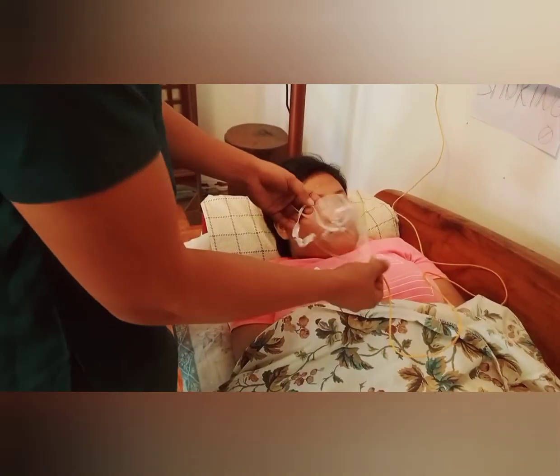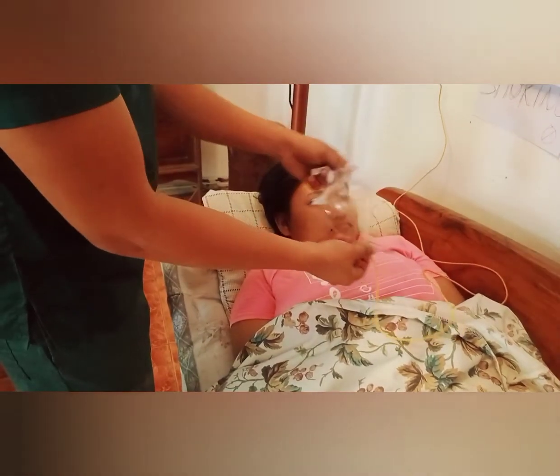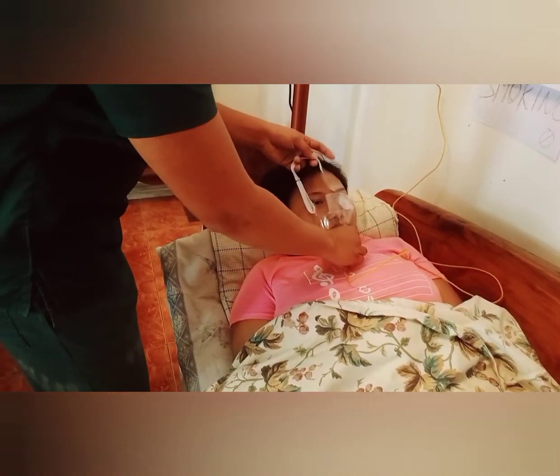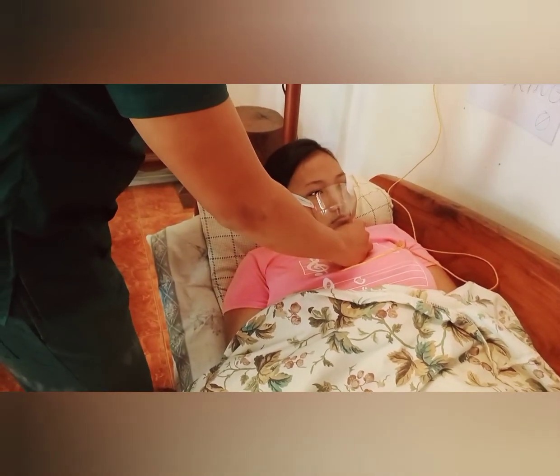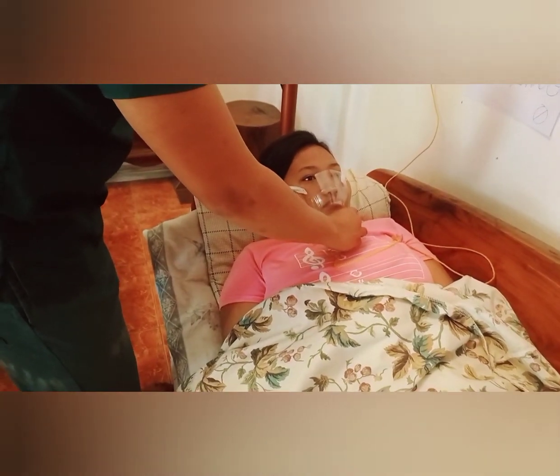Then apply the mask, guiding the elastic strap. So this one is the strap. Place it over the top of the client's head and bring the strap down to just below the client's ears, like this.